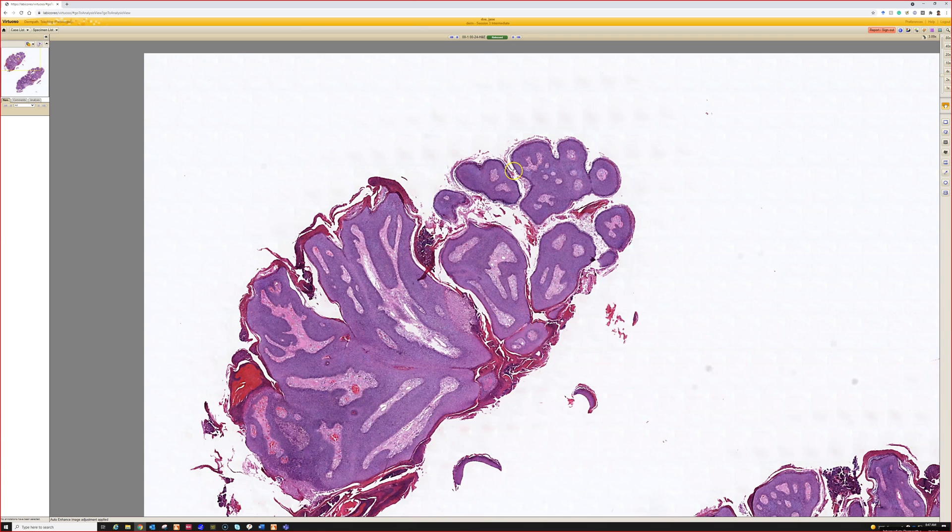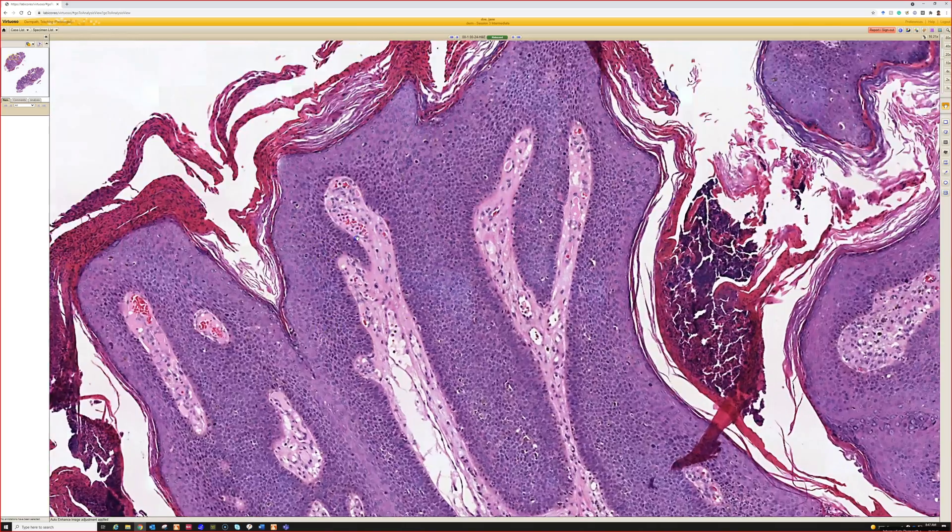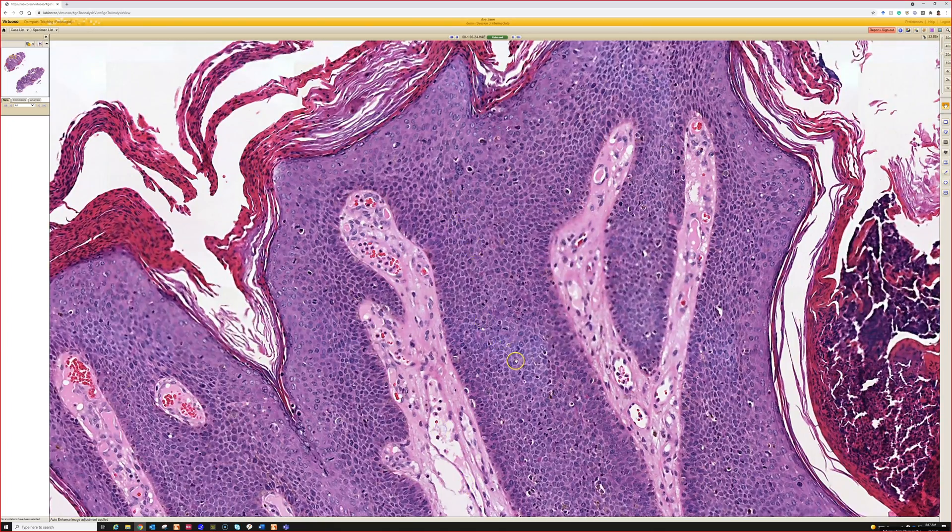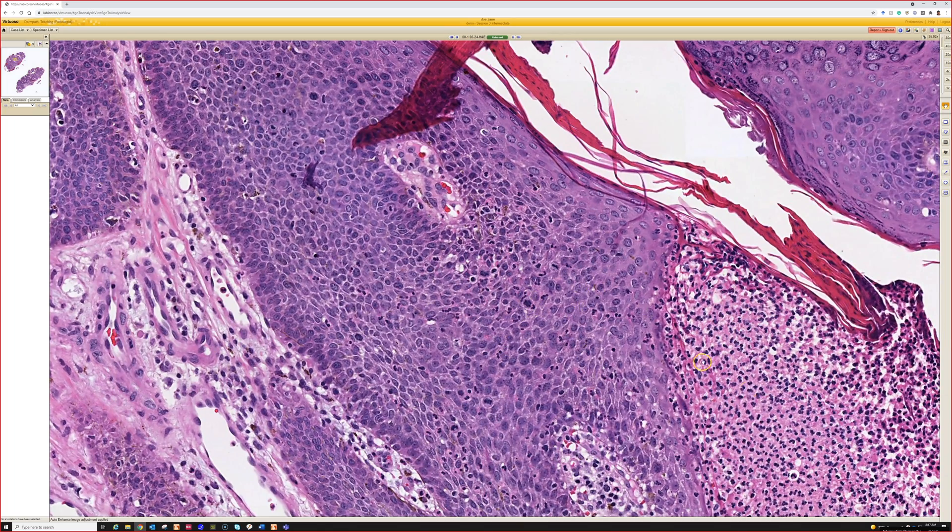And here this thing looks kind of almost like a polypoid seborrheic keratosis. But when we go closer, very blue basaloid atypical cells, lots of mitoses in here.